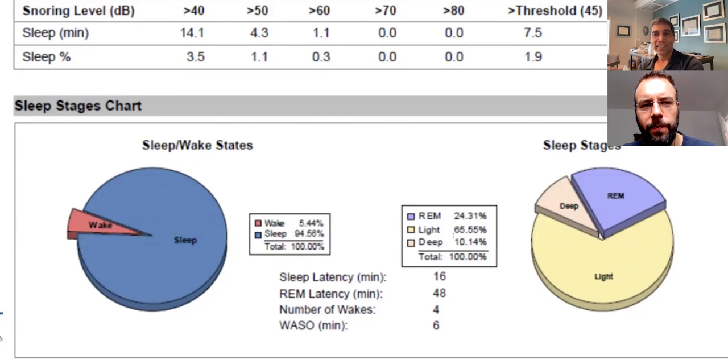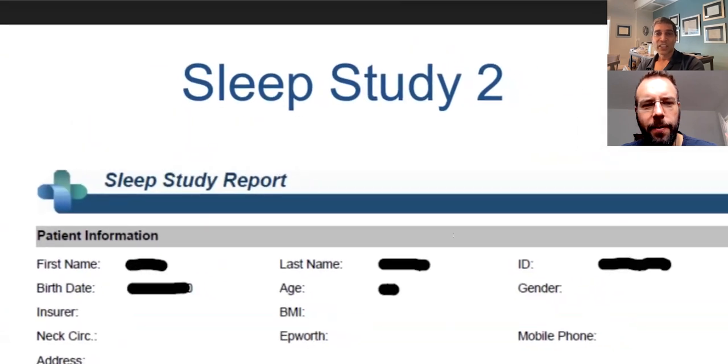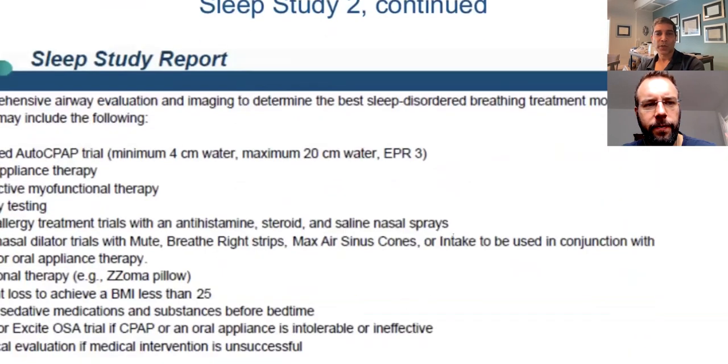Because we got 9 more to go through. Yeah, let's jump on to number 2. I think we covered a lot with that patient. Sure. And the rest should be a little quicker because we've already gone over a lot.